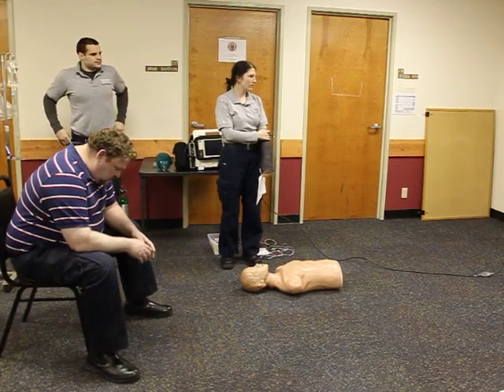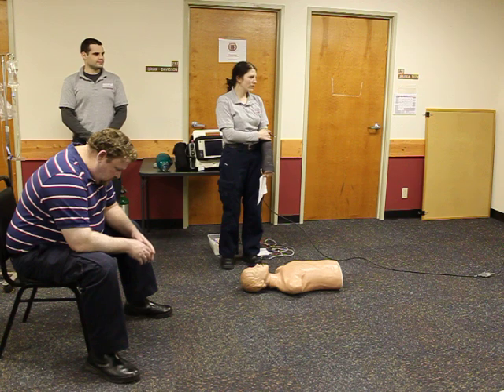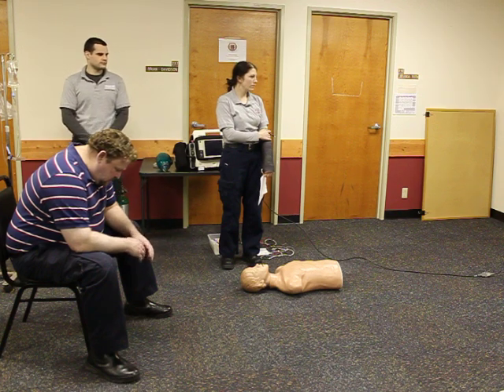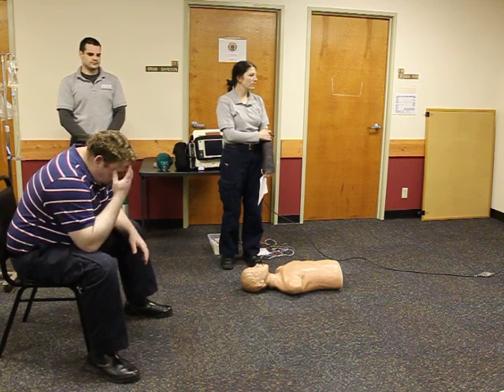This is your National Registry Dynamic Cardiology Station. You are an ALS unit, 3-man team, dispatched to a 42-year-old male's home. Chief complaint, dizziness and nausea.